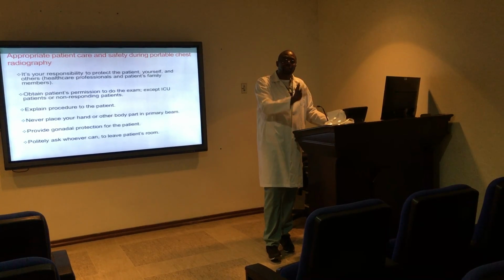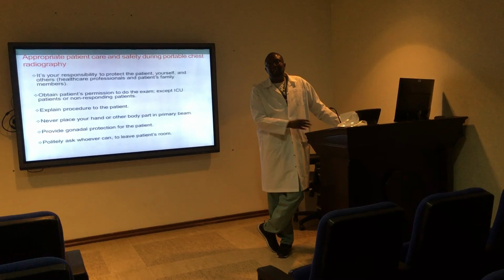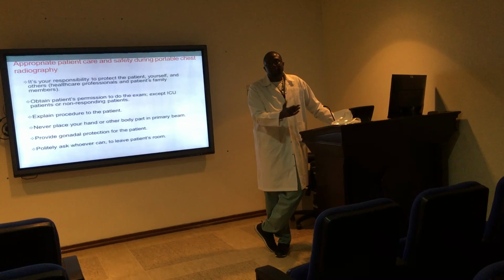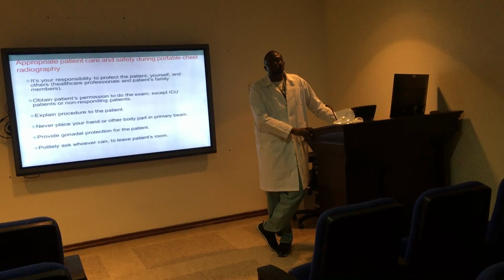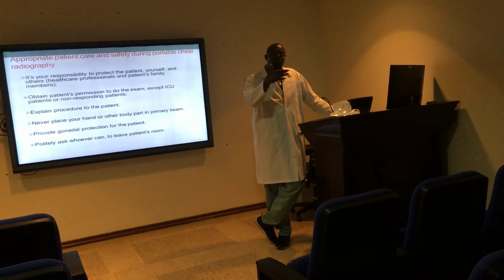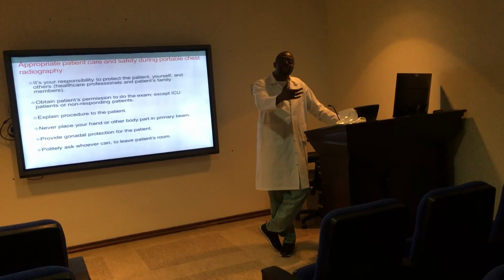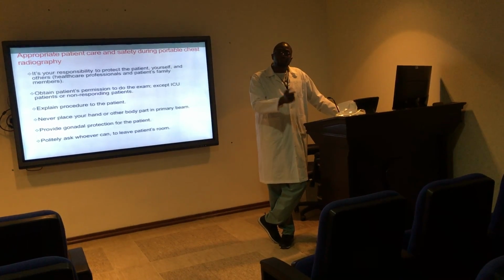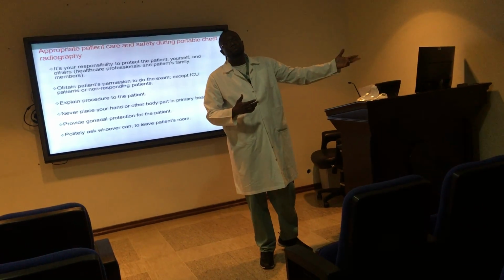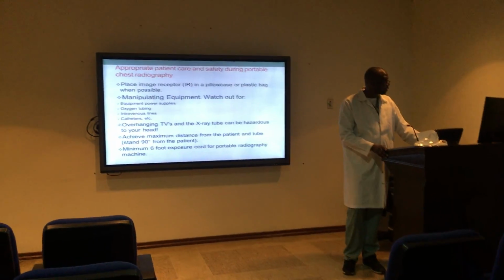There's no need giving scatter radiation to people who are maybe family of the patient. Ask them politely to give you two to three minutes. After the exam, they can come back in. Try to announce in a loud voice, "X-ray," before you make the exposure, so that people around are able to move away from the area.